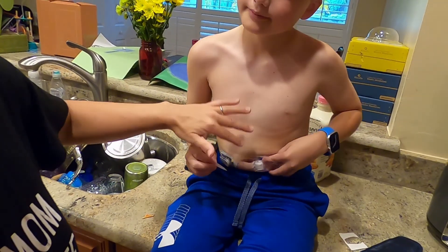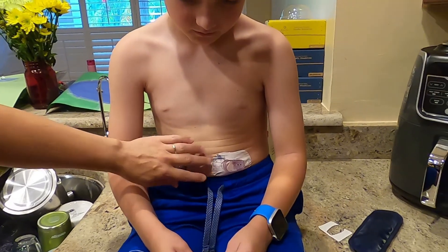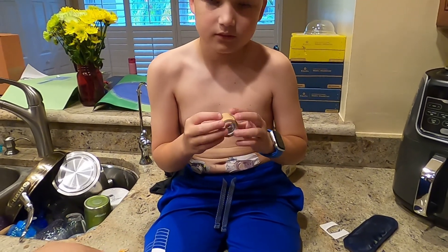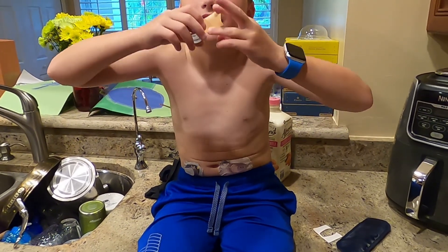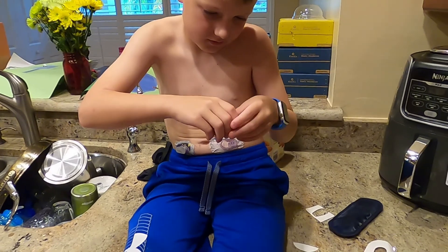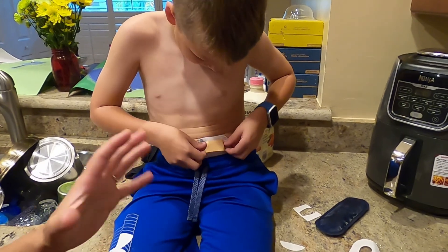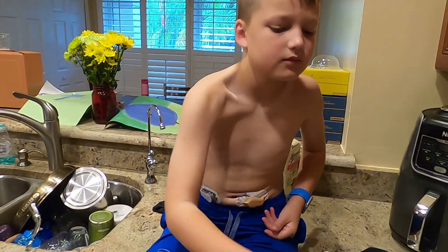Sometimes we let it soak, meaning we just leave that sensor in there before the sensor actually expires. And we would just cover it with some medical tape so it doesn't snag on anything — we would take a strip and cover it. Are we going to switch it over right now or do you want to let it soak for a bit? Let it soak. That's a trick that we learned after months. But we're not going to swim for a while, so let's cover it. And when you and daddy want to switch over your transmitter, the purpose of that is we've just noticed Dexcom will come in more accurate once we start getting readings from the new sensor, if it has a chance to just acclimate to his interstitial fluid — like warm up to it. It's a trick that we read about and it seems to work really well for us.